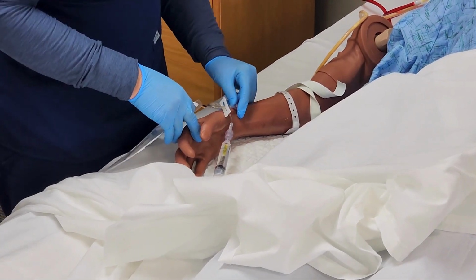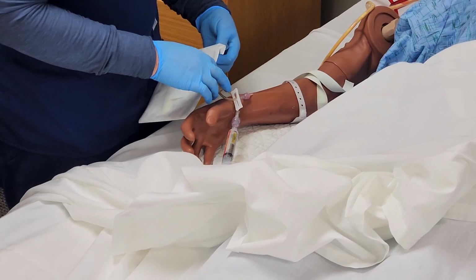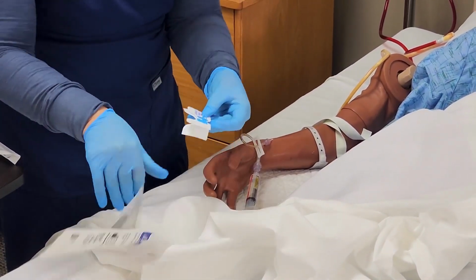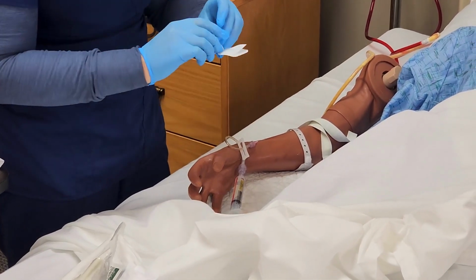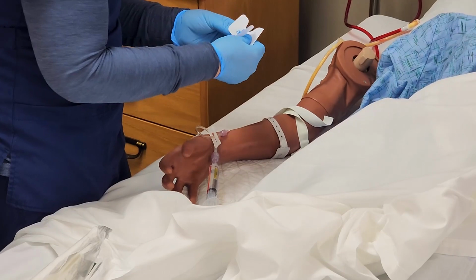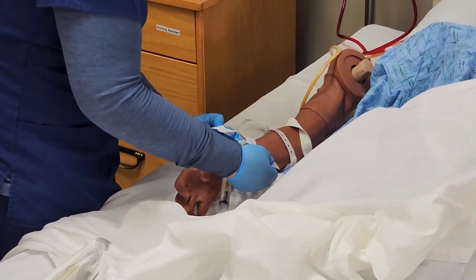And then remind the patient to hold still. And then you're going to go ahead and open up your securement device. There's different types of securement devices, but this is a stat lock.